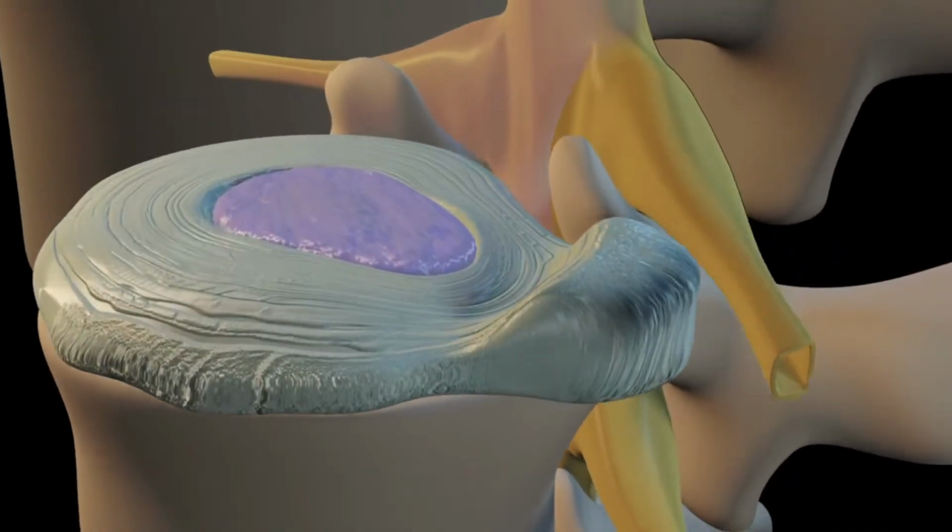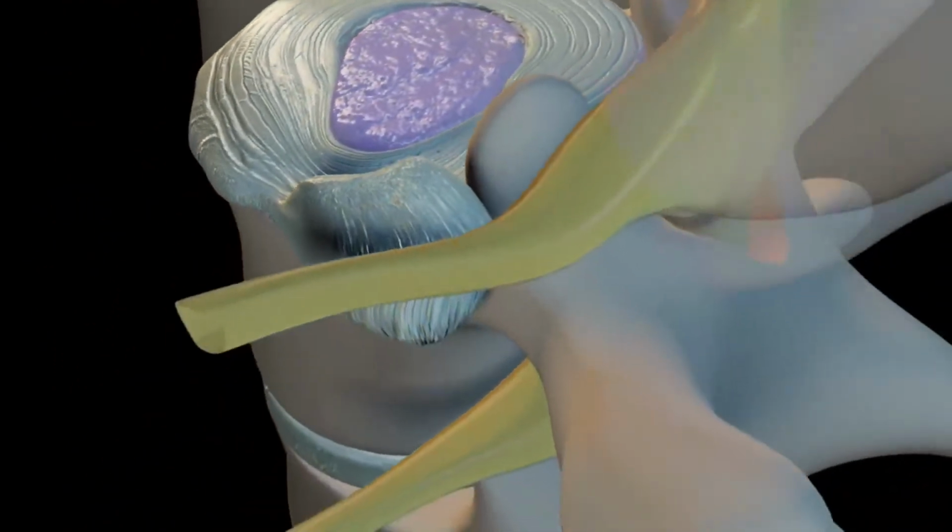And good morning, I'm Dr. Deuk, CEO and founder of the Deuk Spine Institute. I'm here with a patient who has traveled here to have his neck fixed. He had a herniated disc. We did his surgery just yesterday. Yes, sir. It was outpatient, Deuk laser disc repair, endoscopic.